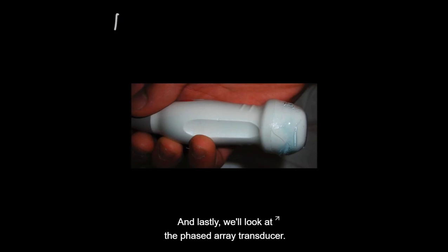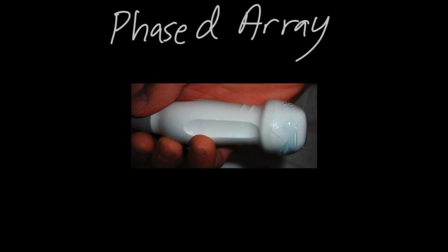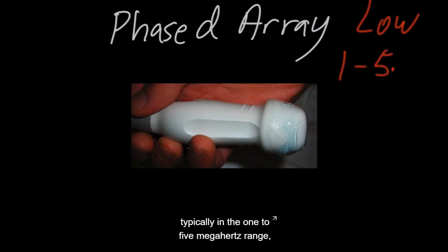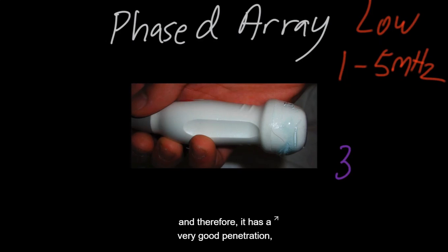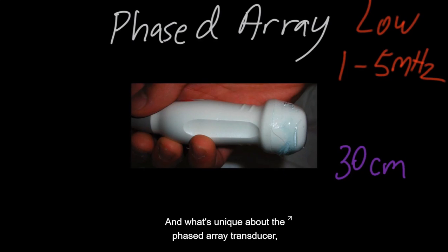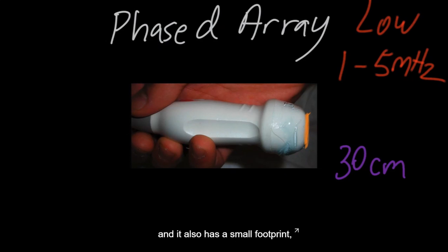And lastly, we'll look at the phased array transducer. The phased array transducer is a low-frequency transducer, typically in the 1 to 5 megahertz range. And therefore, it has a very good penetration, usually up to 30 centimeters of depth. And what's unique about the phased array transducer, it also has a flat surface, like the linear transducer, and it also has a small footprint, or a near square footprint if you were to look at this image head on.